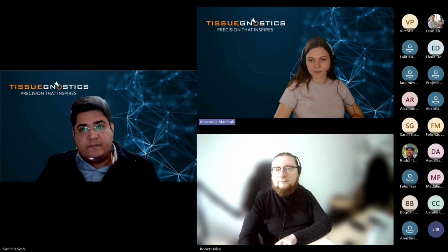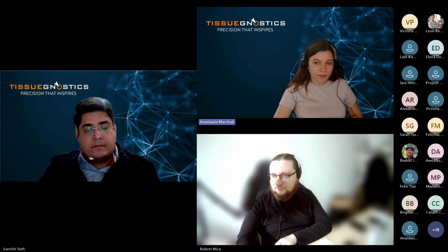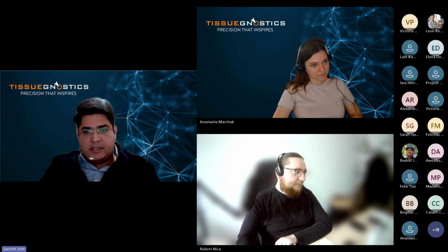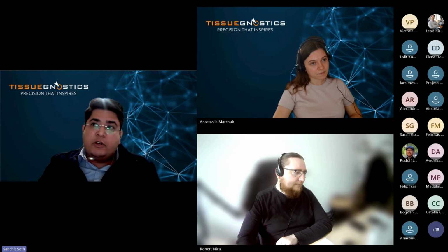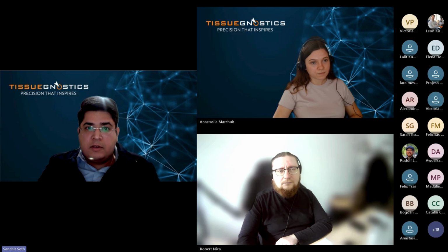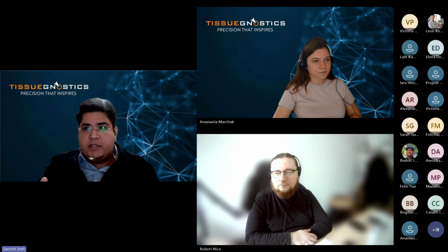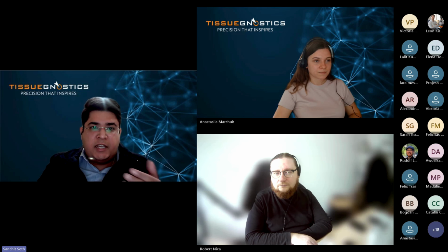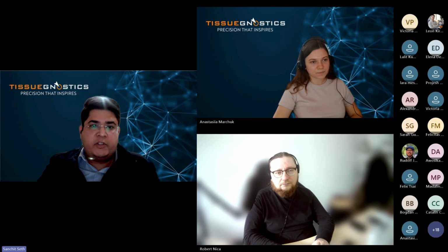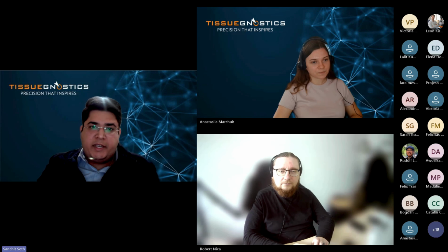I see. Thank you. Okay, next question. I use the Opal kit from Akoya. Is it compatible with StrataQuest? Yes, I get this question a lot. We do not put any restrictions on what kind of staining or what markers to use. Basically, if you can stain it and scan it, we can analyze it. We do not put any restrictions on which markers or how many channels. So yes, we are compatible with Opal kits.